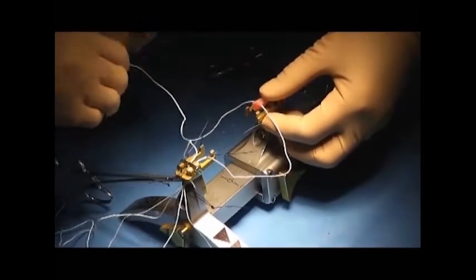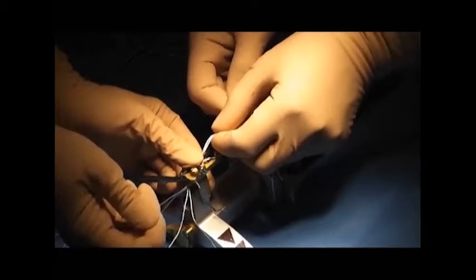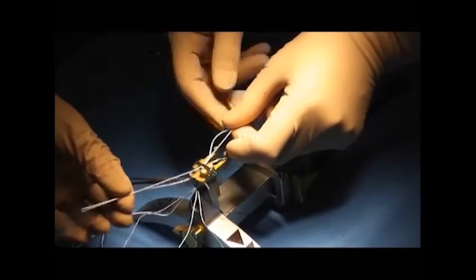Pass the end of the white braided suture through the opposite temporary black loop and make a fold. The scrub nurse slowly pulls on the thread end of the temporary black loop while firmly holding the plate. During this operation, the surgeon holds the white braided suture and makes sure that the temporary black loop goes into the splice while counter-pulling slowly on the splice.